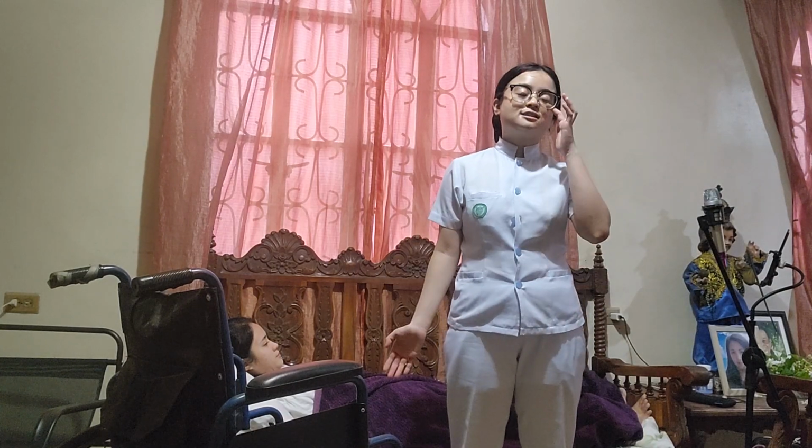So that's the end of my visual presentation, demonstrating how to transfer the patient from the bed to the wheelchair and vice versa.